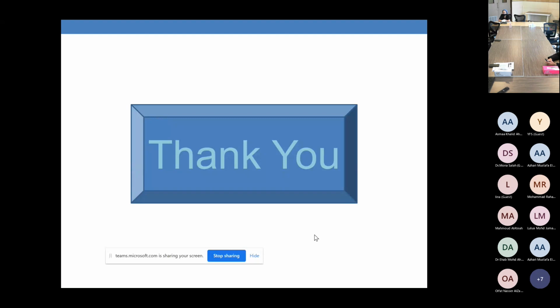Thank you. Totally agree, totally agree. And as we said, the graphics is adding value. So it is not substituting your clinical sense. You need to disconnect, you need to try bagging, you need to check the air entry, you need to do the transillumination, do a chest X-ray. But this is really adding value to what you are doing in your clinical practice, watching your surroundings and seeing what's going on.